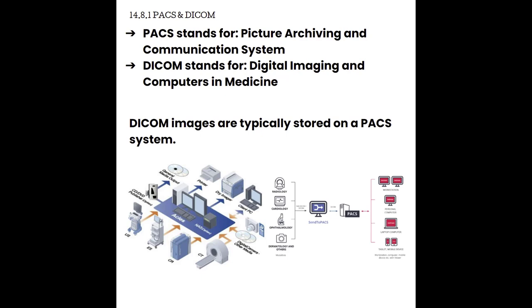You can have instant access to old images. The images are not going to get ruined over time. And you can see those images from remote sites. You don't have to be at the PACS system to be able to see them. So here we are at our machine. We end the exam. The exam gets saved on the hard drive temporarily until it falls off or has to be deleted. But those images are definitely going to go to the PACS system.